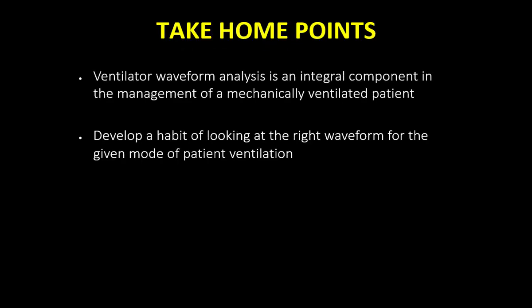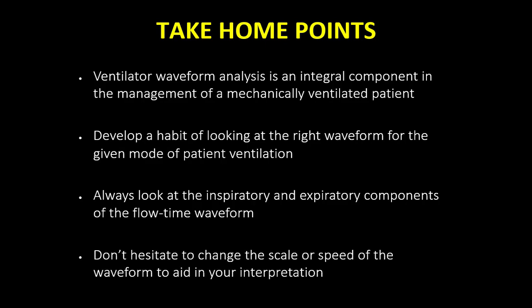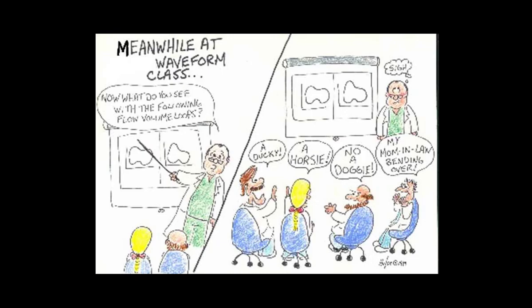Take home points. This is an integral component of managing a patient on mechanical ventilation. Always make it a habit. Always look at both the inspiratory and expiratory part of the flow waveform. Do not hesitate to change the scale or the speed to aid interpretation. And at any stage wherever you're confused, you can always ask for help. That is something which one should never be shy about. Thank you.